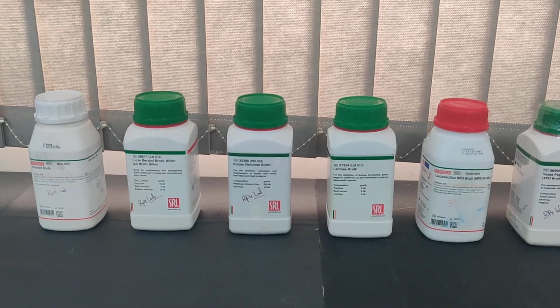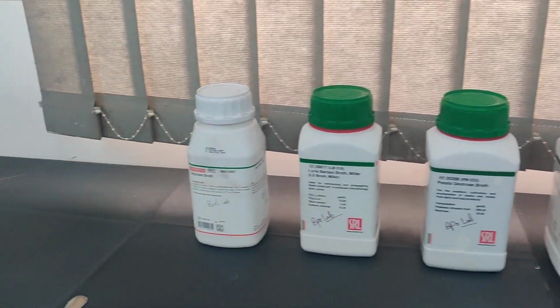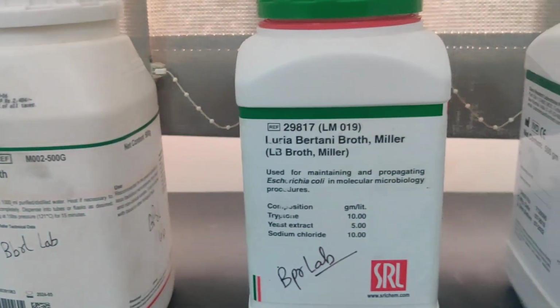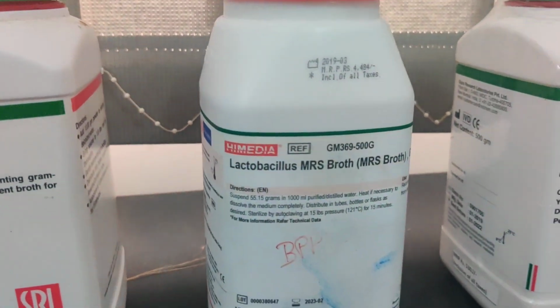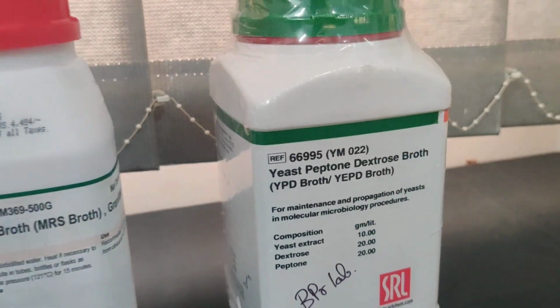Whenever you go for a liquid medium, you have to select a broth, like nutrient broth, LB broth, potato dextrose broth, lactose broth, Lactobacillus MRS broth, or yeast peptone dextrose broth.